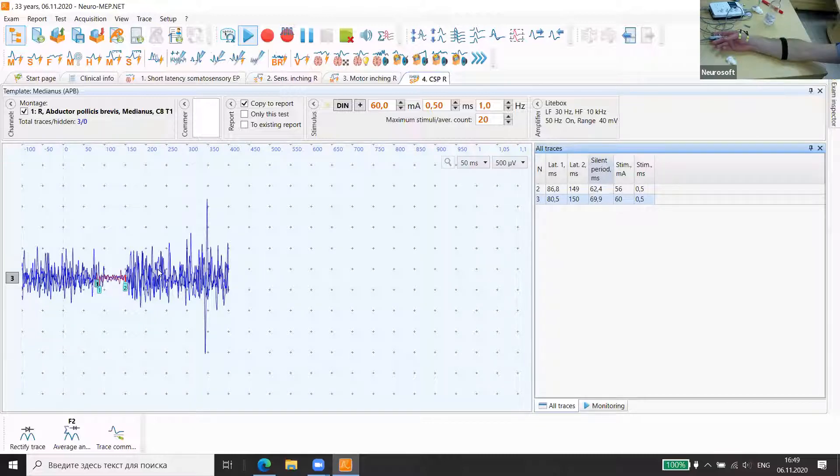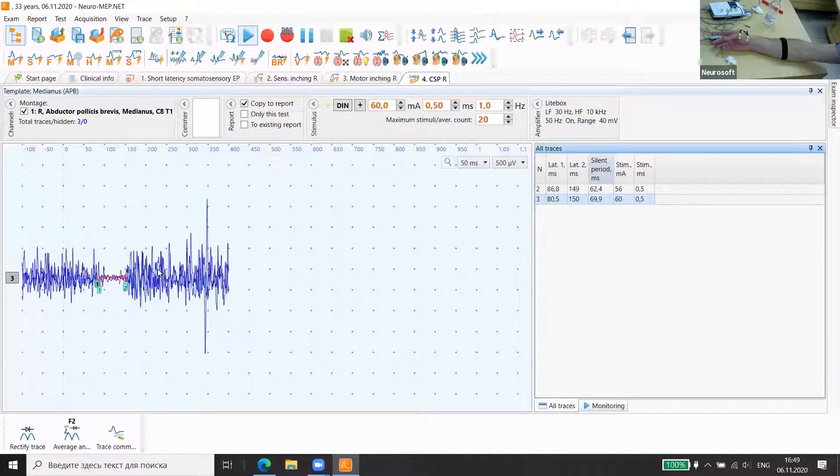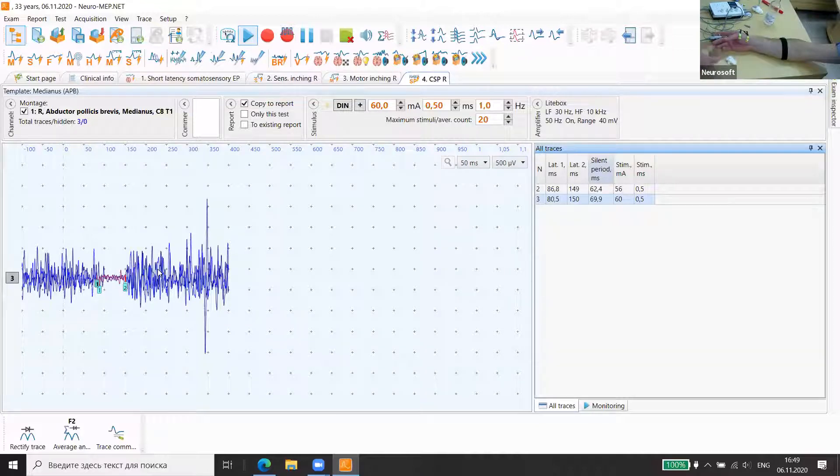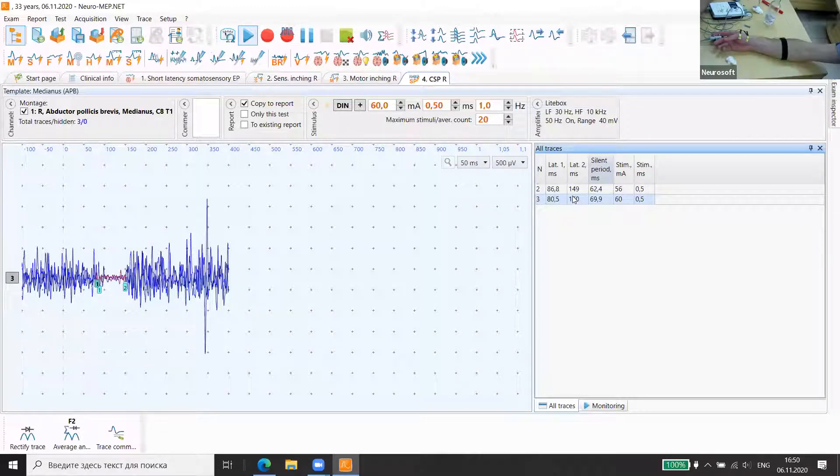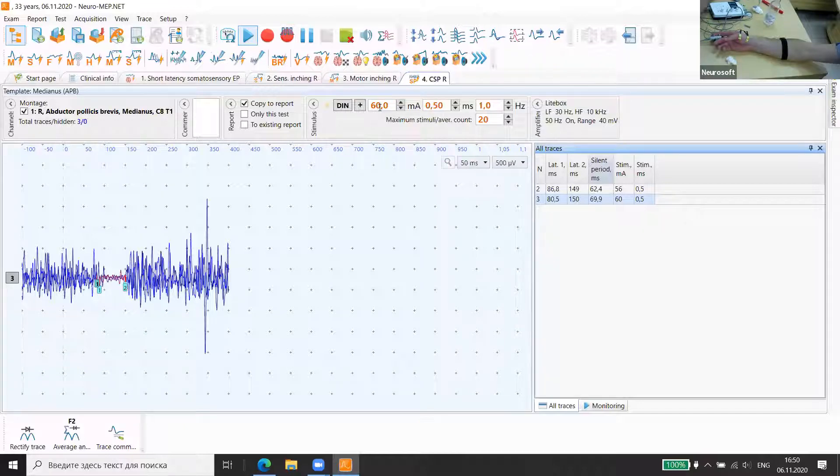So it changes its duration throughout different neuropathies, for example, carpal tunnel syndrome. Ideally, we should increase some more, but for demonstration this is very clear. Okay.